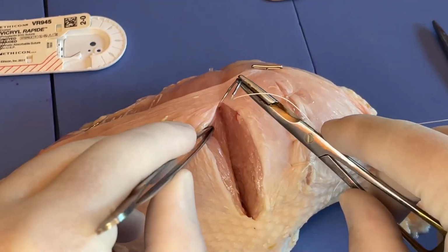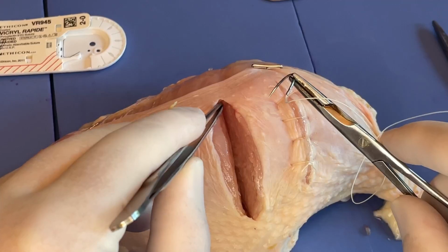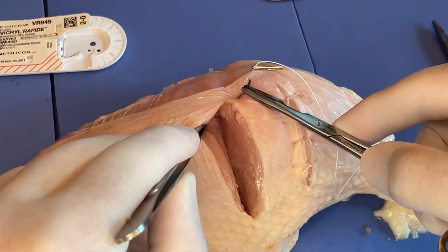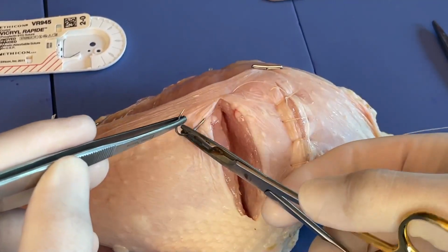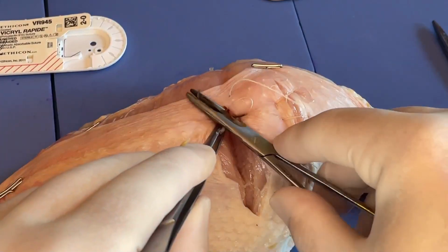So in general, we usually start up beyond the apex of the incised or lacerated tissue, because any divided tissue could be a source of bleeding. So we want to come up just beyond the apex. See our needle tip here in the middle. We'll come out in the middle, regrasp, go back in, and again pop out just up behind that apex.